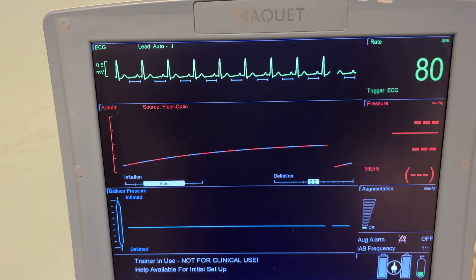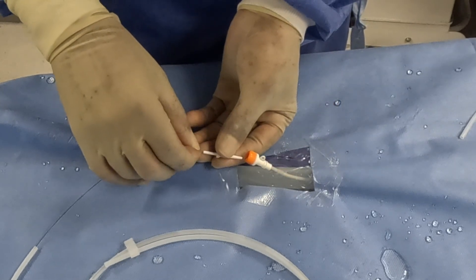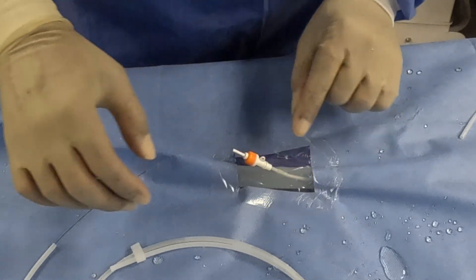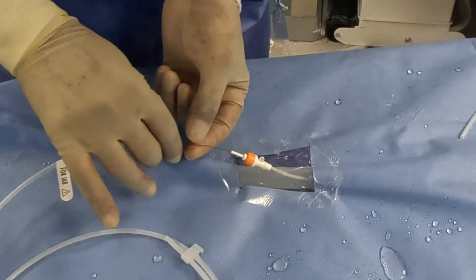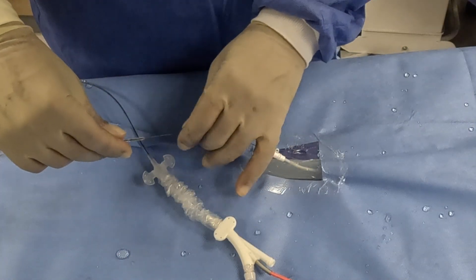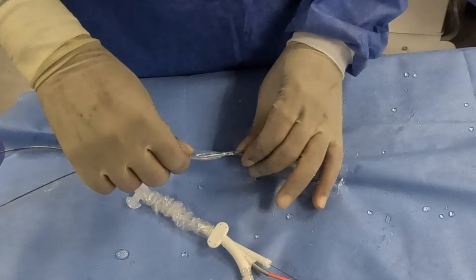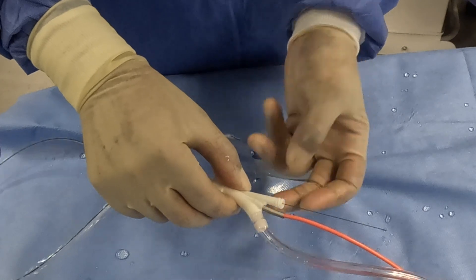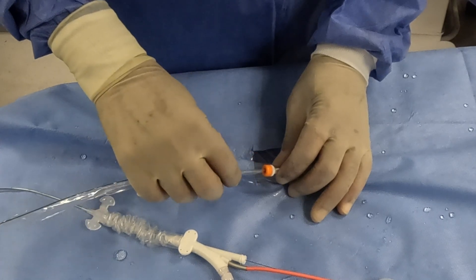Get the ECG waveform on the console screen. Insert the intra-aortic balloon guide wire, which is 145cm long, through the sheath and place it in the descending aorta. Advance the catheter into the descending thoracic aorta, usually under fluoroscopic guidance to ensure proper positioning. Insert the intra-aortic balloon catheter over the guide wire through the sheath introducer.